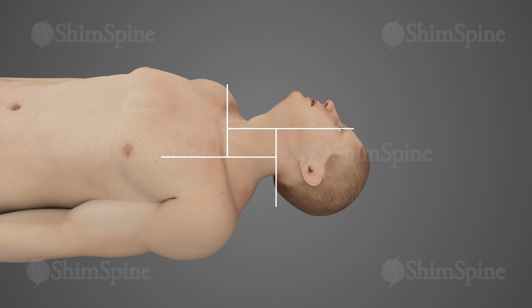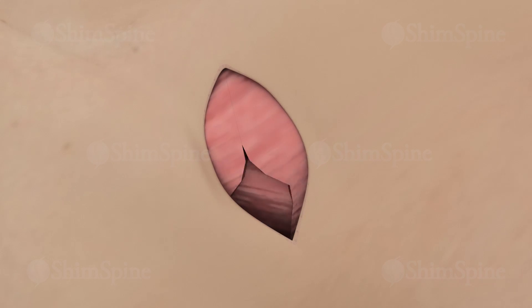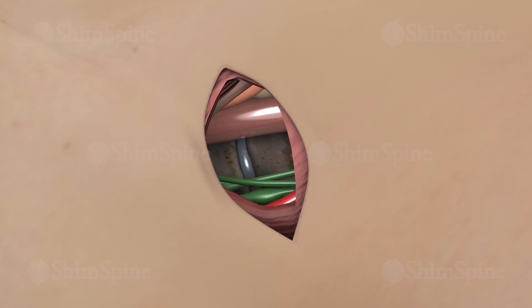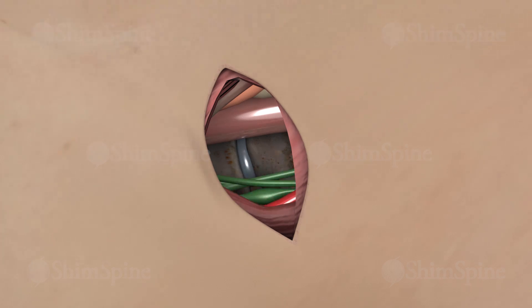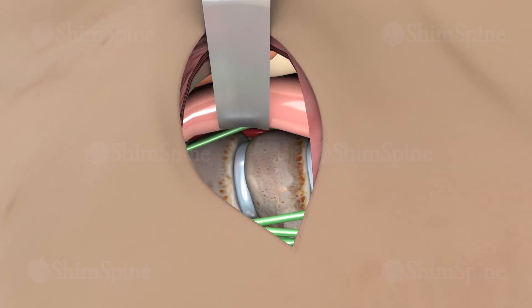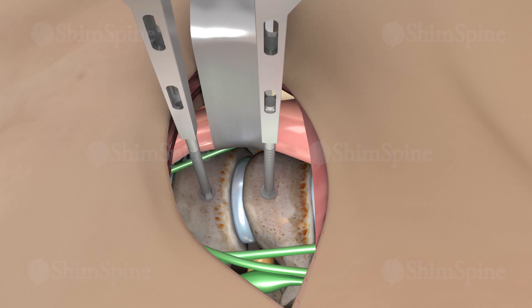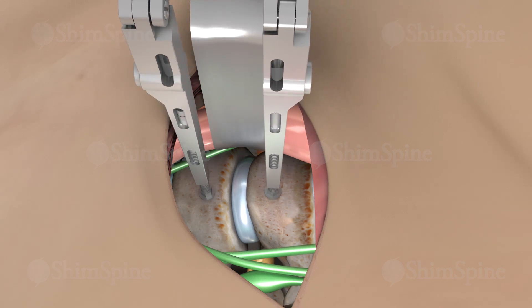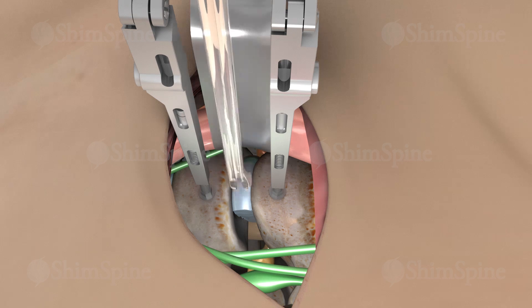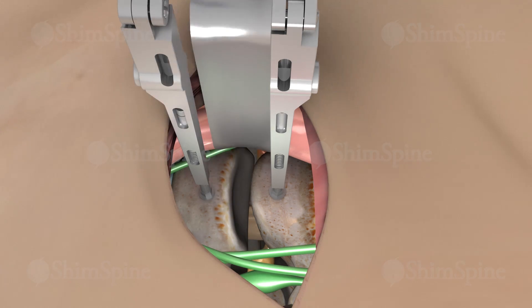Surgery is performed through an incision on the front of the neck. Care is taken to dissect safely between the intervals between various muscle groups, and to protect the windpipe, the food pipe, and the arteries and veins. Once the bones of the front of the neck are exposed, the disc herniation is removed from the disc space, taking pressure off the thecal sac, the individual nerves, and the spinal cord.